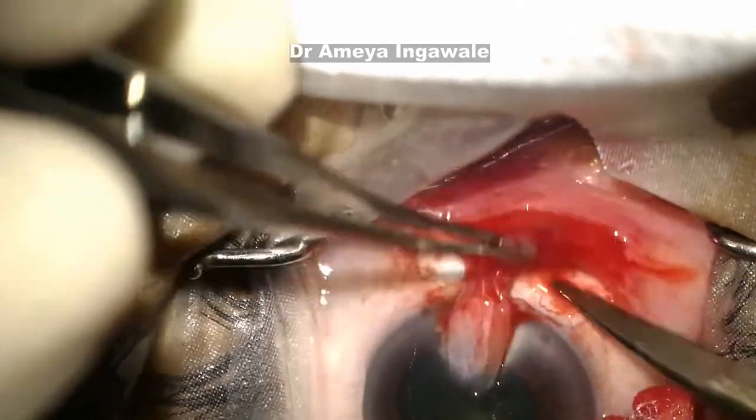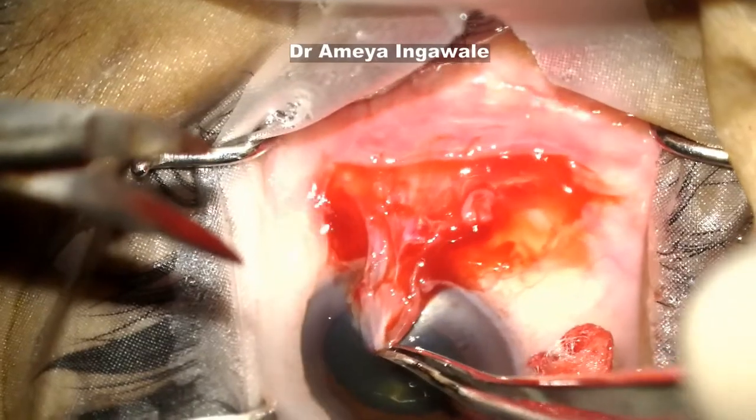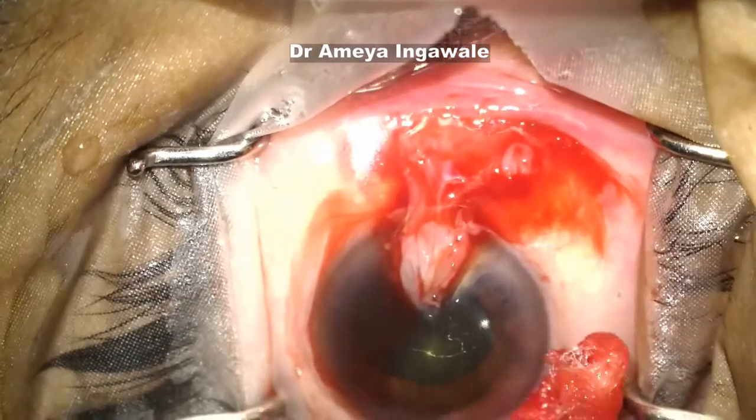Using adrenaline in the block helps to keep the bleeding at a minimum. Make sure you remove all the pterygium tissue from under the pterygium as well.